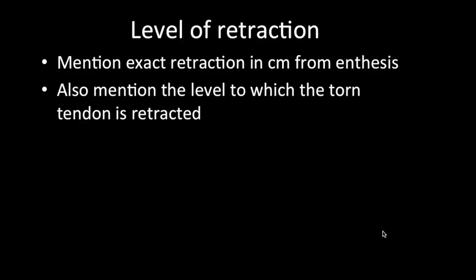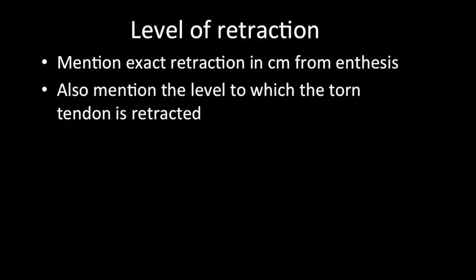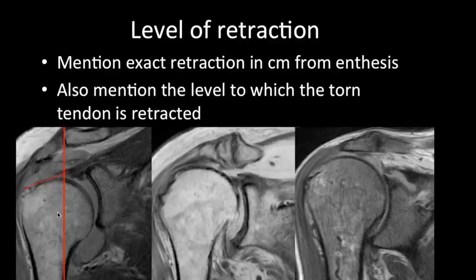Next, mention the exact retraction of the tendon in centimeters from the enthesis and the level to which it is retracted. Measure from the greater tuberosity to the retracted tendon margin for the centimeter measurement. By level: retracted to the mid humeral head, retracted to the glenohumeral joint line, or retracted medial to the glenoid.